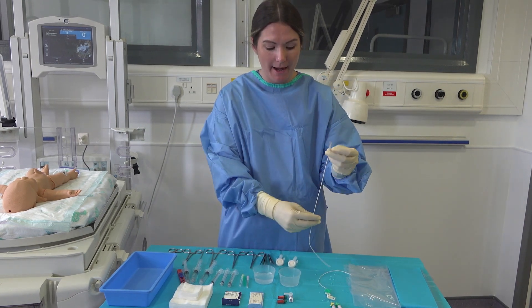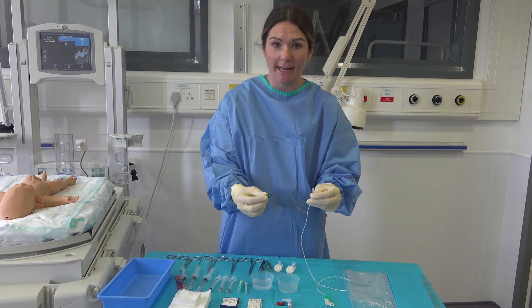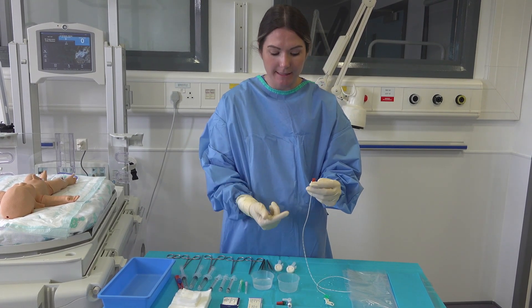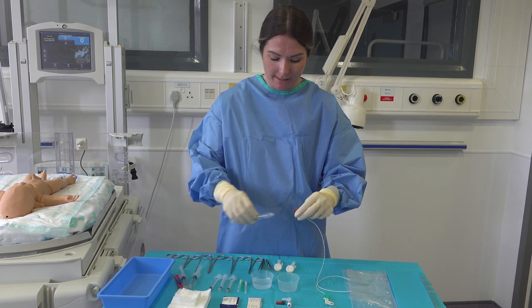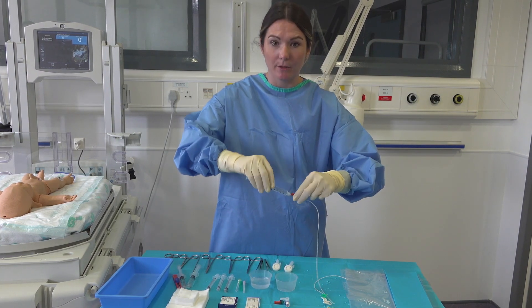Next I'm going to prepare my UAC. For this I'm going to put a red luer lock on the end of this for insertion. This is to make sure that none of the arterial blood comes up through the line when it's being inserted, and again making sure it goes all the way through.